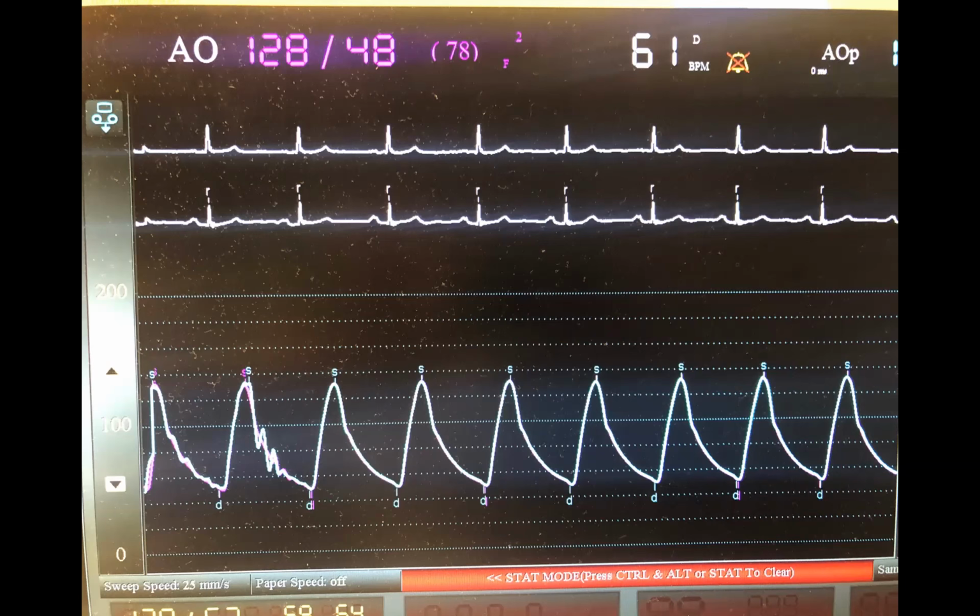Another thing to keep in mind when using FFR wire is ectopy. You really want stable measurements. And when you have a flimsy wire flopping around in the ventricle, you'll create ectopy. So there are issues with damping, drift, and ectopy when you're using FFR wire.